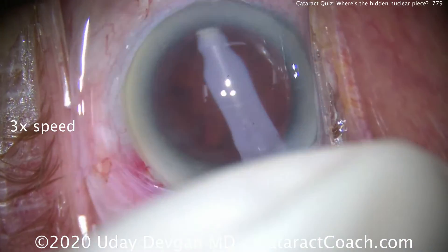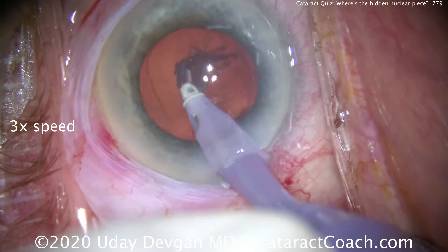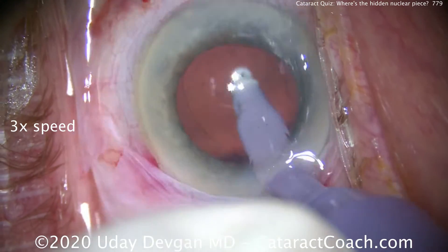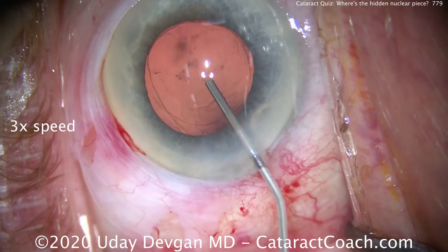Time for cortex removal. Let's get that IA probe in hand, put it inside the eye, and clean this up. I want to speed up the video and get to the IOL insertion, because that's where we see the surprise.